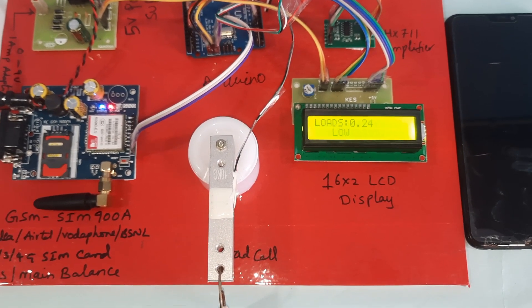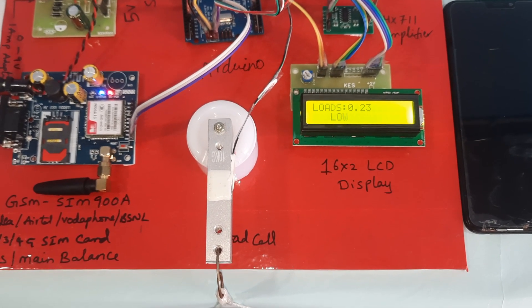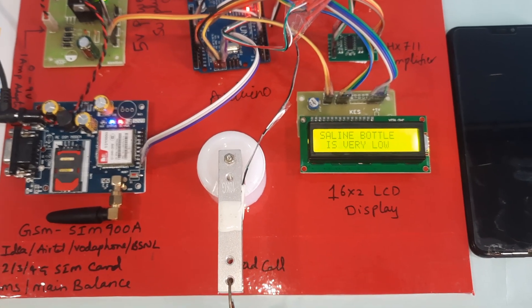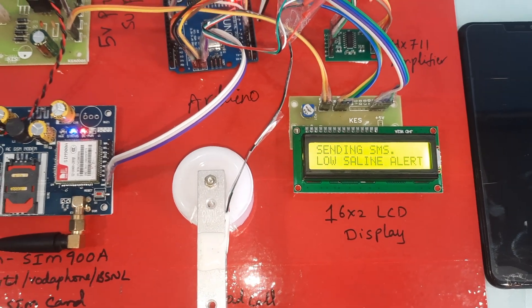The system measures 4 to 5 counts, then sends the SMS alert. The LCD displays: 'Saline bottle is very low.' The system is sending the SMS low saline alert.